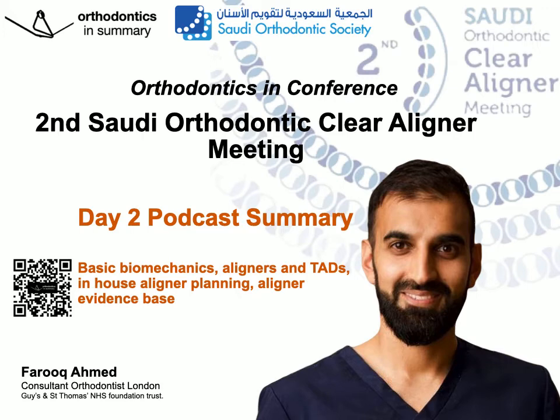So to start off with, Benedict described how bodily movements are a challenge for aligners. Distalizing more than 2 millimeters is unpredictable, and expansion mainly takes place through tipping movements, by Hole 2017 and Zhou 2020. And he said that TADs make a very good adjunctive interaction with aligners to conquer these challenges.